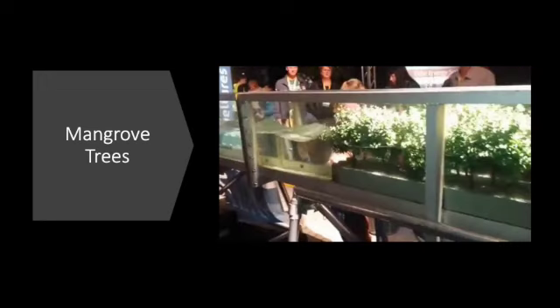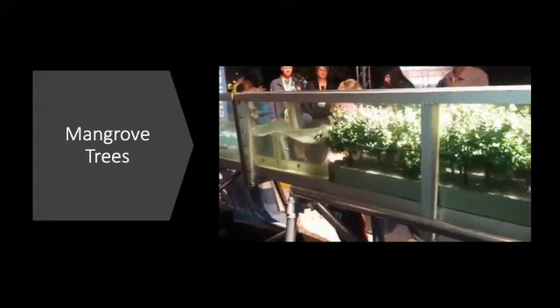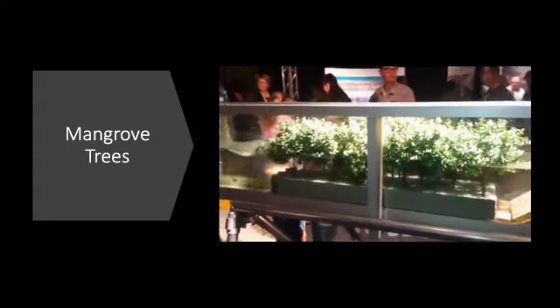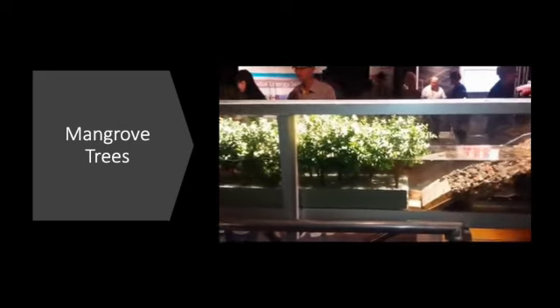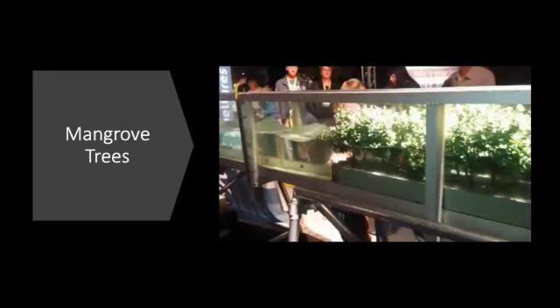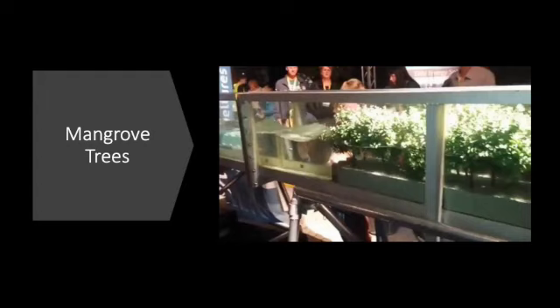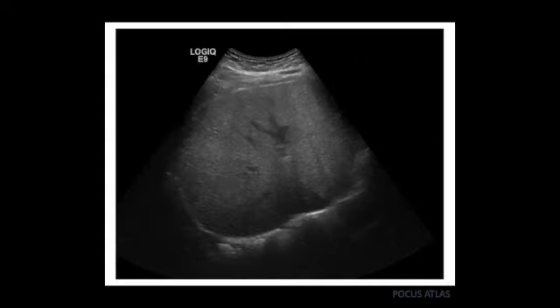You can see as those waves come in on one side of the screen here and then pass through the mangrove forest, that wave energy is dispersed. And so there's relatively little movement of that beam on the other side of the forest. And that is a perfect analogy for ultrasound attenuation. Ultrasound attenuation refers to the gradual loss of ultrasound beam intensity as it propagates through a tissue.